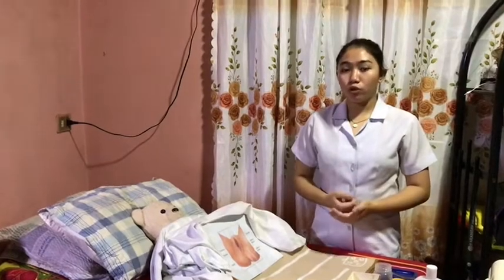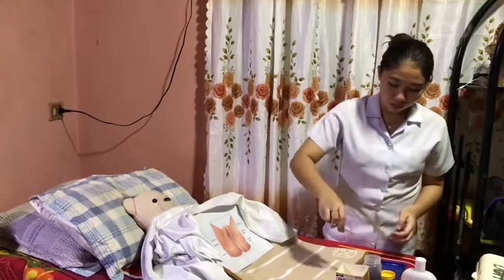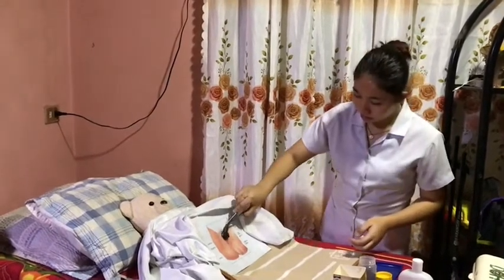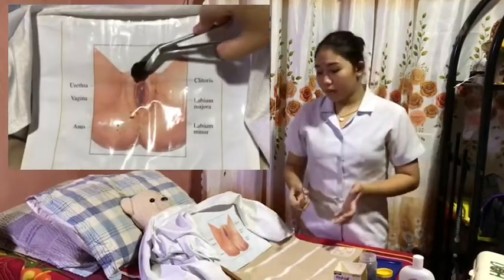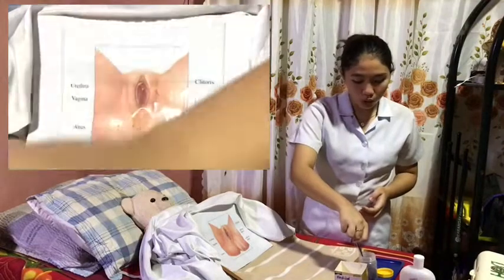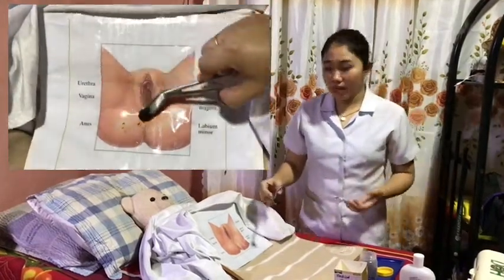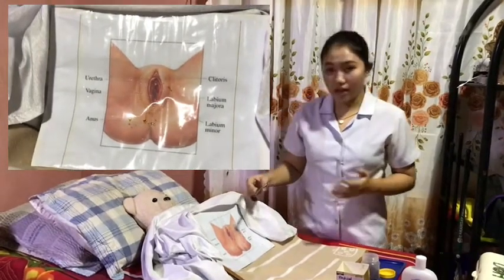Now I'm going to use my sterile forceps to cleanse the genital area with the cotton balls soaked in cleansing solution. Alright, the first line first. Always remember not to retrace the stroke because it may contaminate the area that was cleansed.